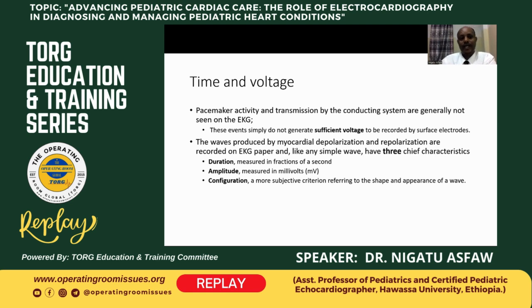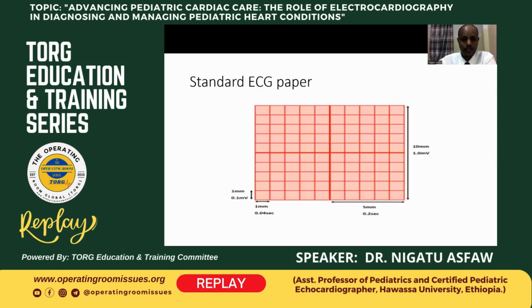And durations are recorded in fractions of seconds, and amplitudes are recorded in millivolts, and there will be configurations, that means the waves of the ECG can be upward or downward, and we need to study the shape and appearance of these waves. And this is standard ECG paper.